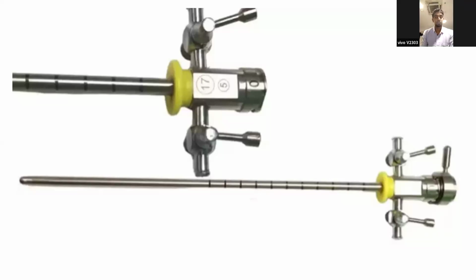Another use you have missed is that you can measure the prostatic length. If the same scope is used in the prostate of a male, it can be used to measure how long the prostatic urethra is. The remaining uses we have already told. Then the instrument below is not only an obturator, it is an assembled instrument along with the sheath. You initially told that down is the obturator and up is the sheath. So down is the sheath with obturator. Yes, sir.